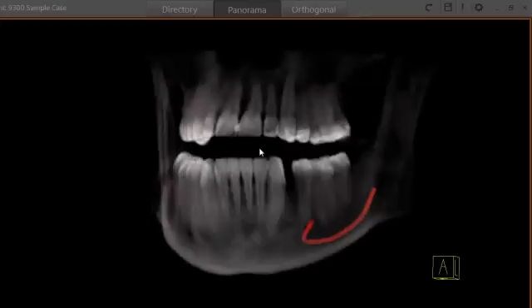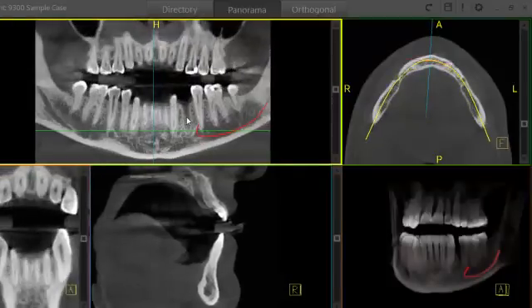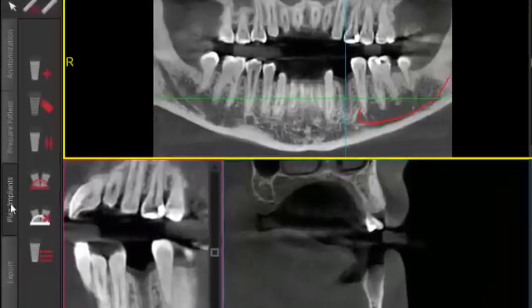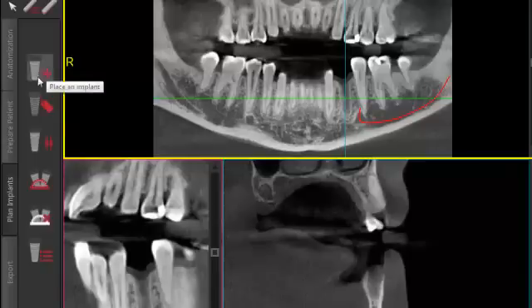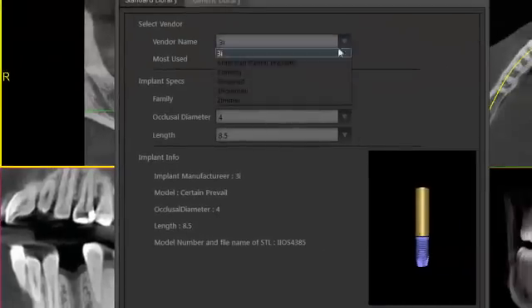Ready to plan our implant. I'll begin by clicking on our edentulous site and moving down to the plan implant tab. We've got a couple of libraries you can choose from — a generic library, or for this particular case I'm going to use a Zimmer implant, so I'll go straight to all of my implant libraries and go to vendor name.